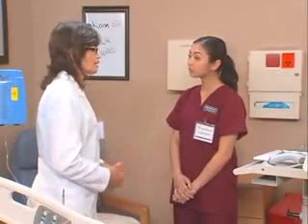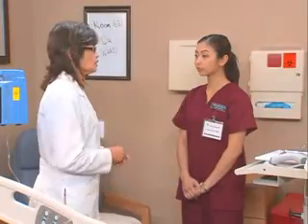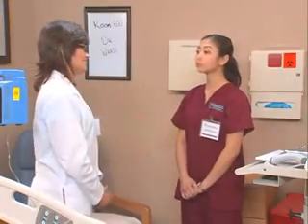Now, if you're suspicious of a reading, wait at least a minute before you try it again. Remember, if you want to recheck the pressure reading, do not reinflate the cuff once the air is being released. Wait 1 minute and repeat the measurement.